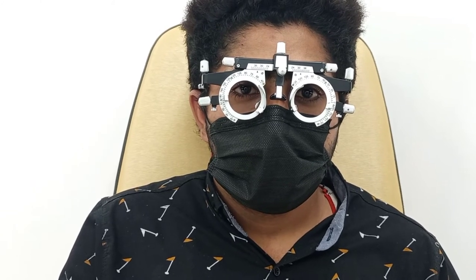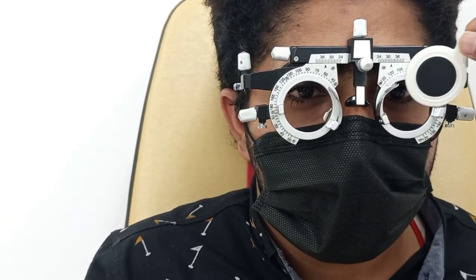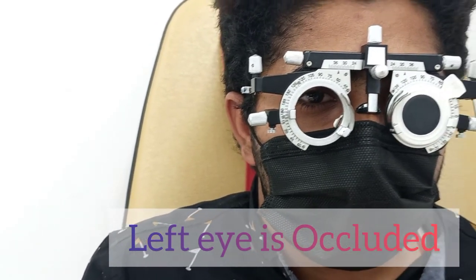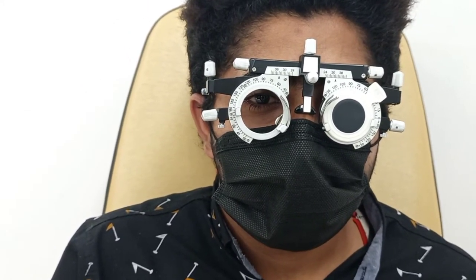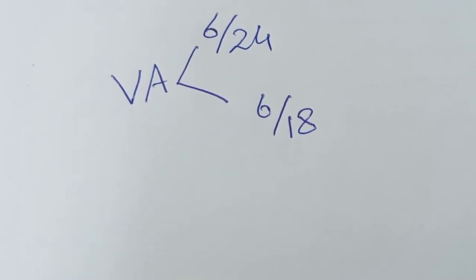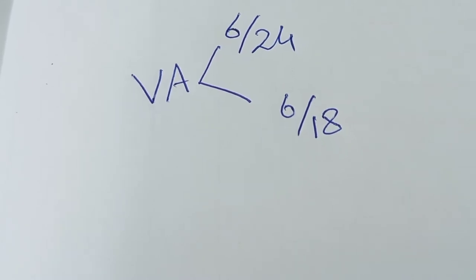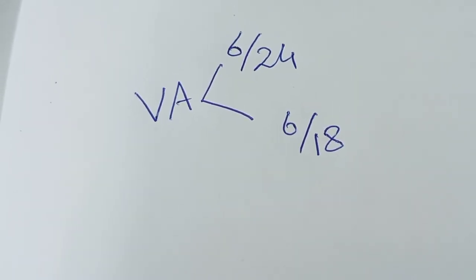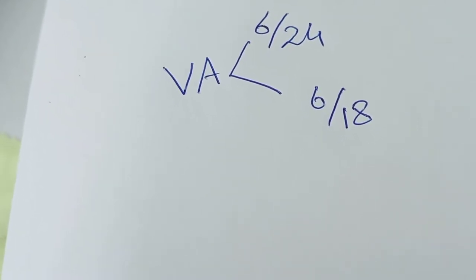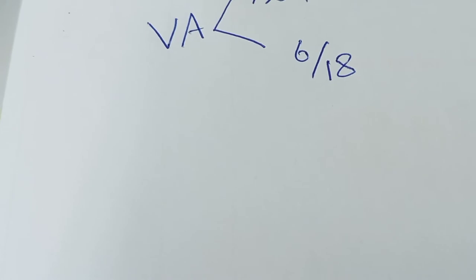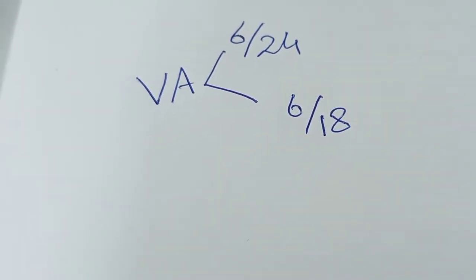We will place the trial frame on the patient's face and occlude one eye. The left eye is occluded and we will establish the best vision sphere of the right eye. The recorded visual acuity of the right eye is 6/24 and the visual acuity of the left eye is 6/18. We will now establish the best vision sphere in the right eye.